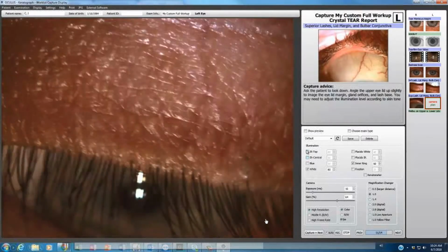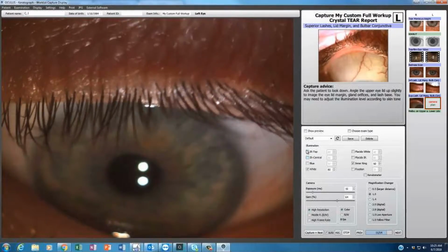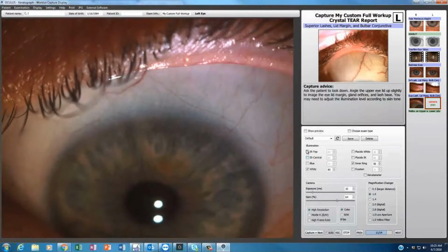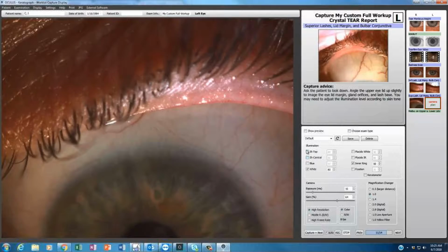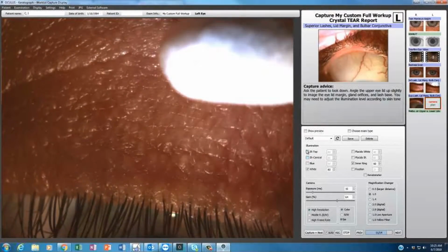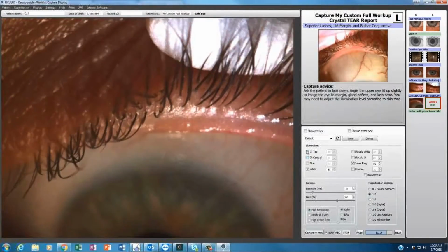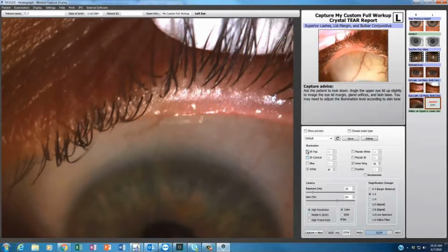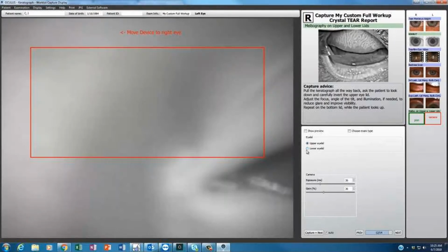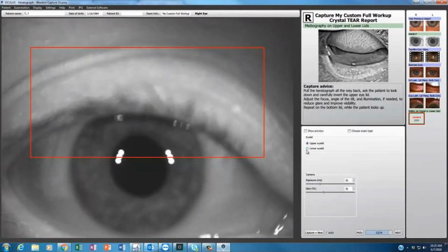Because he's going like this one, and that one, and that one. I just wondered how long it let you, if you were in session. I think you do it, you go back, you do it. I don't know if you remember when I was going over that customization editor. You saw that particular one on that full workup. They had, I want to say, 5 or 6 images of just the lids too. So it depends on whether you're doing a screening exam or a full workup, and which pictures you have set up to go in there.